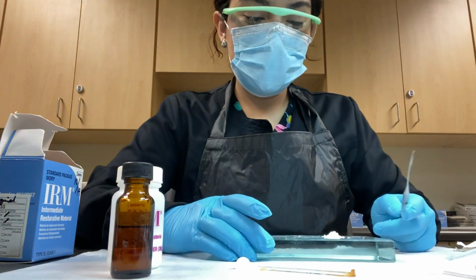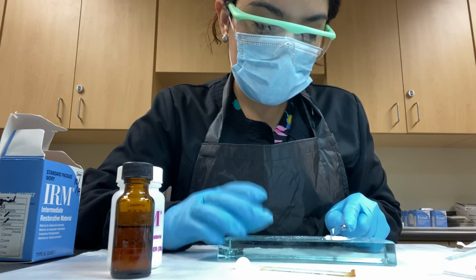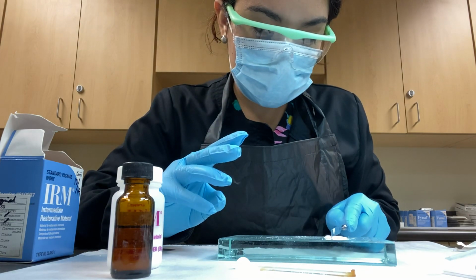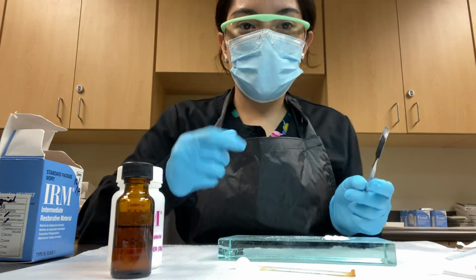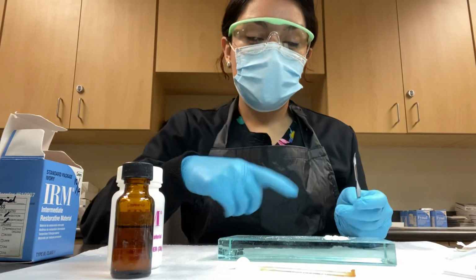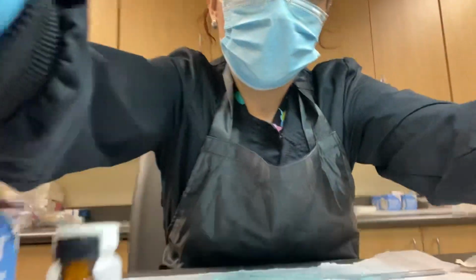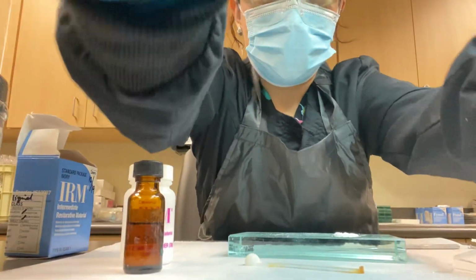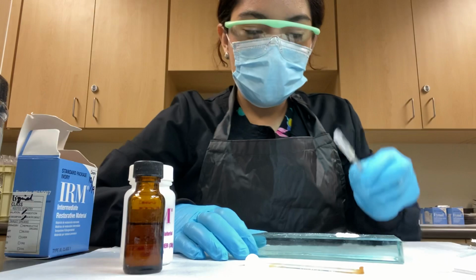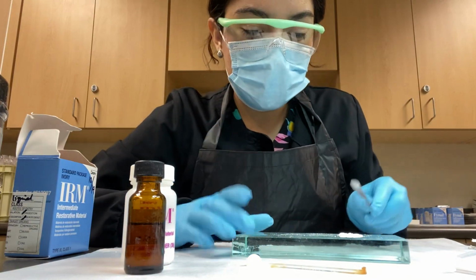And then before I begin mixing, I flatten out my powder, and I'm gonna separate it into 3 increments. So you mix the first increment first with the liquid, and the second, and then the third. And so this is how I have it set up. Okay, and now I will begin to mix for 1 minute.